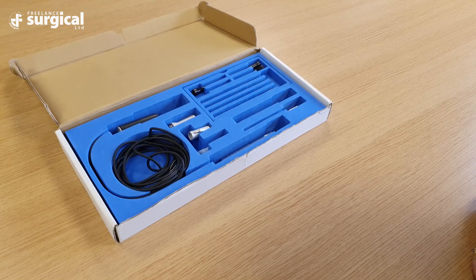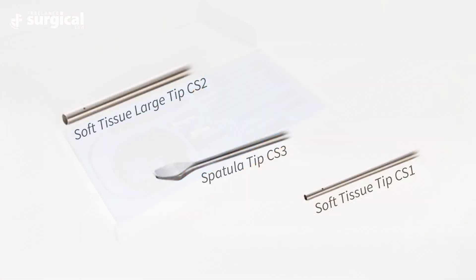Before assembling the handpiece, the surgeons will need to decide which ultrasonic tip they're wishing to use, depending on whether they want to emulsify tissue, soft tissue or to cut through bone. There are three soft tissue tips available: a narrow soft tissue tip, a large soft tissue tip and also a spatula tip. These are denoted by CS1, CS2 and CS3.